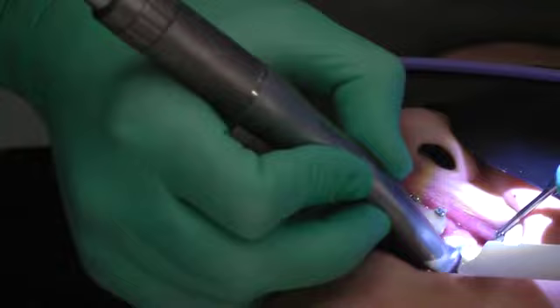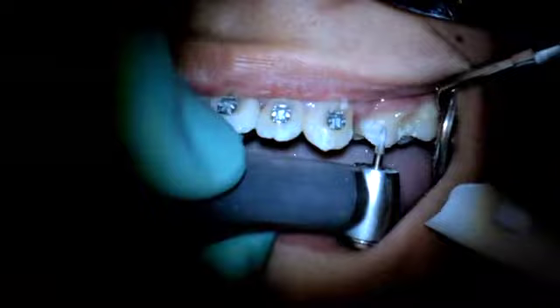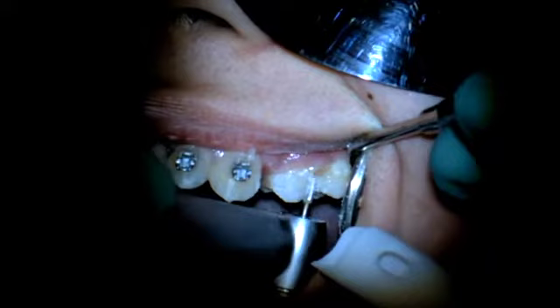The torque of this is in between a high speed and a low speed. We ignore the interproximal for now — we're going to clean the tooth surface first, and then the interproximal we'll go around with a scaler.